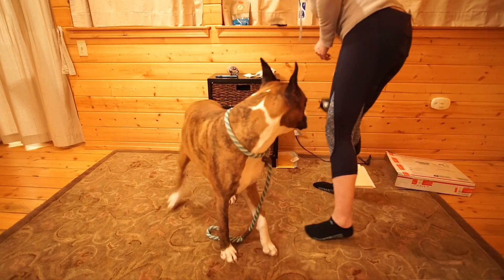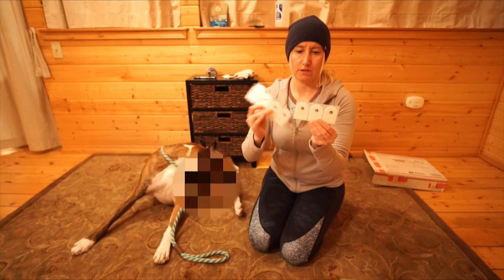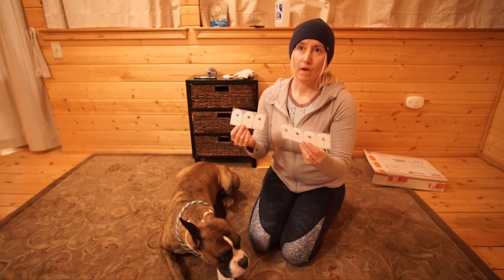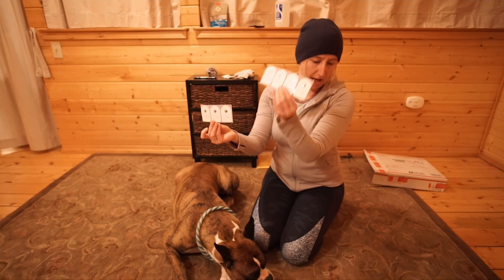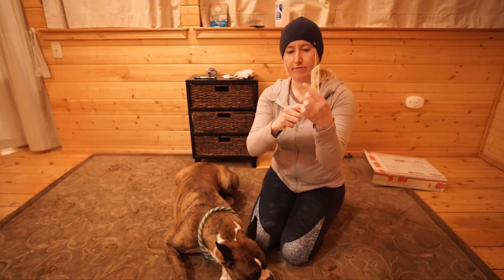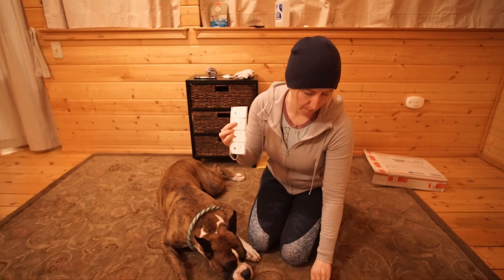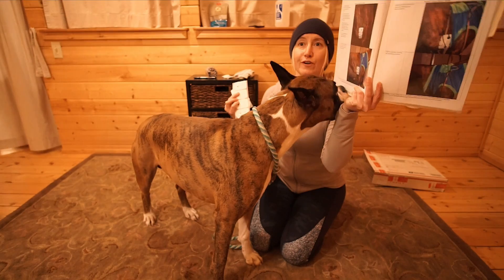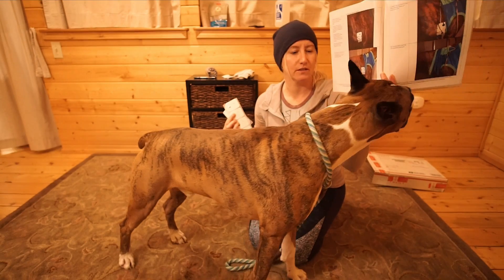So we have the electrodes. These are adhesive on one side which stick to the dog, and then the lead snaps on here, as you can see. The right side gets three and the left side gets four, and you have to alternate the snaps so each one goes the opposite way. Luckily, there are photos for us to go by, so we have some idea where they're going and what it's supposed to look like.